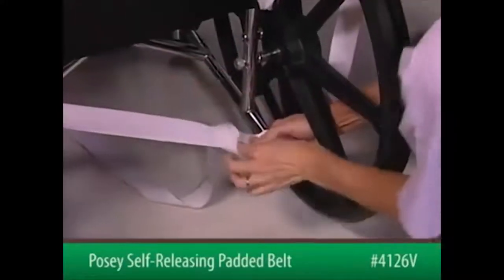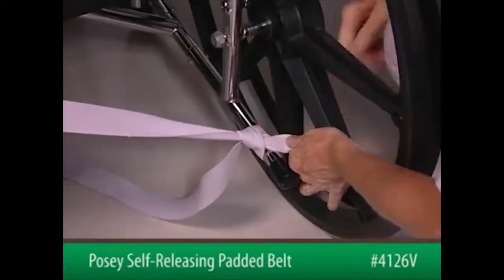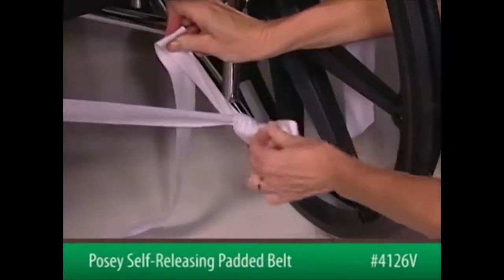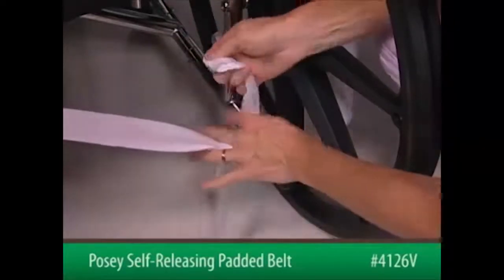Next, drape the loose end over the tension strap and pull it through to form a loop. Take the remaining loose end and form a second loop, and pull this through the first loop. Pull up to tighten.